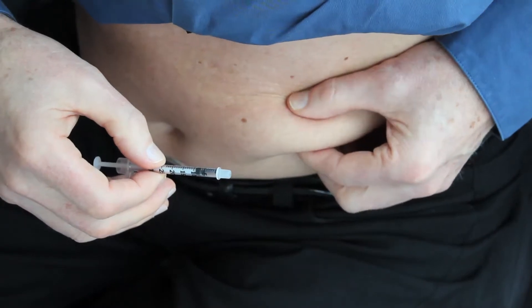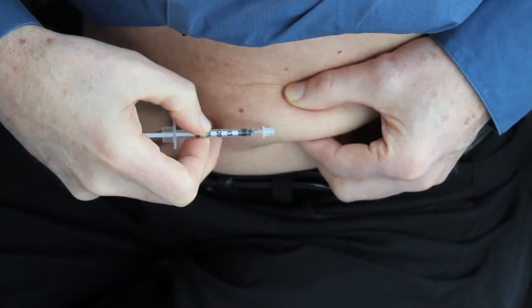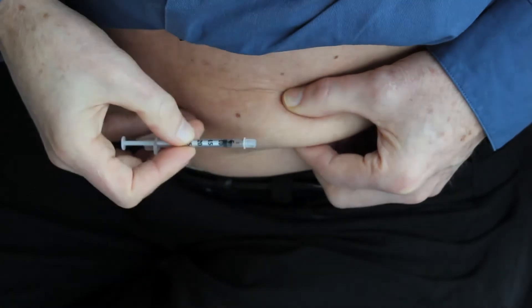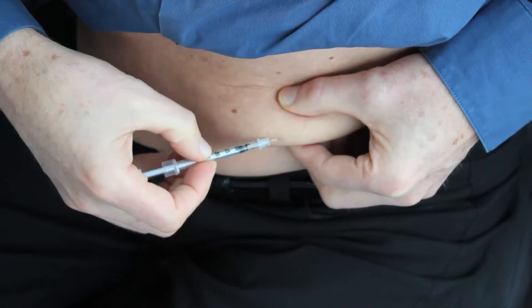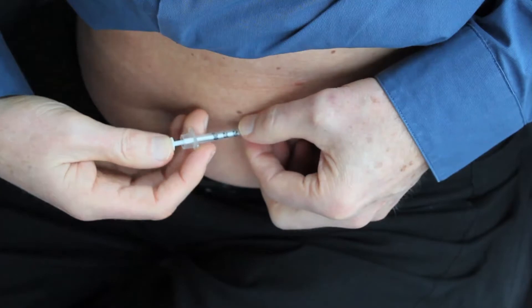Once the skin response fades, which takes two or three days, you can give yourself an injection back in that place again. Pinch your skin with your thumb and index finger of one hand, and use the other hand to hold the syringe with your thumb and index finger. The injection should be given at about a 10 or 15 degree angle to the skin — nearly flat — so that it goes just under the skin. When you're ready, insert the needle underneath the skin.